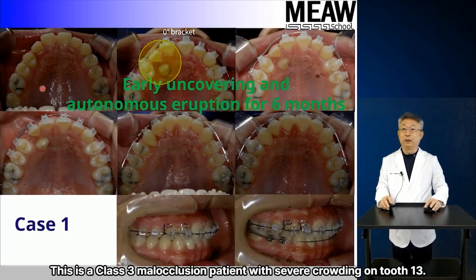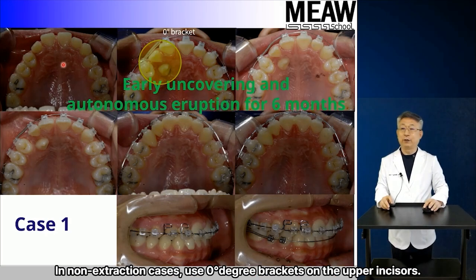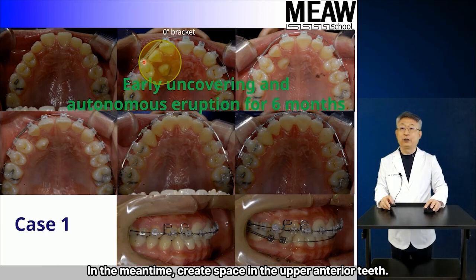This is a Class 3 malocclusion patient with severe crowding on tooth 13. Tooth 13 should not be extracted if possible, because its extraction can lead to arch distortion. In non-extraction cases, use 0-degree brackets on the upper incisors. As already mentioned, surgically expose the palatally impacted teeth and wait about 6 months for eruption. In the meantime, create space in the upper anterior teeth.